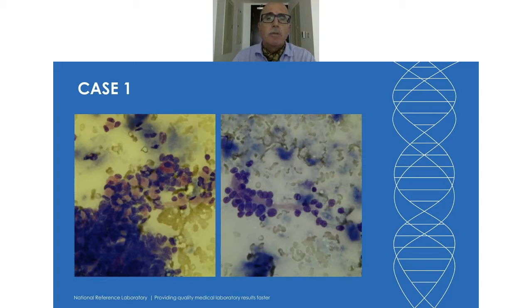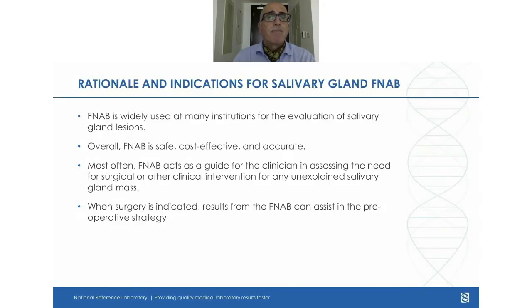It wasn't really merging with the background, and the cells did not have a spindle appearance, but were relatively epithelioid.